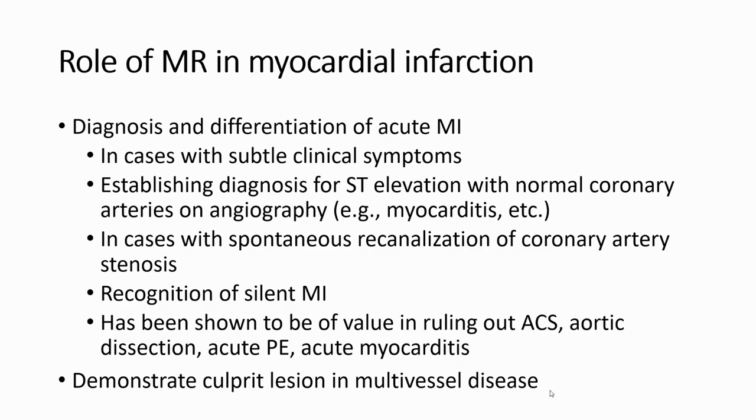Role of MR in myocardial infarction: diagnosis and differentiation of acute MI.